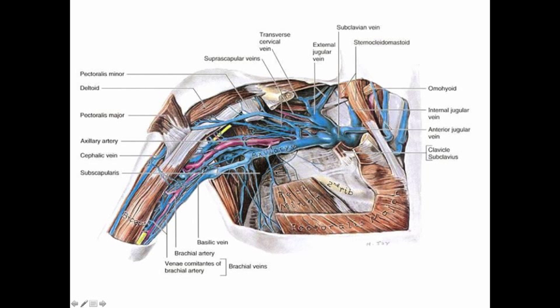The subclavian vein can also be imaged with ultrasound for vascular access. I think this is something we don't do quite as often, but there's growing evidence that we should. While the subclavian vein lies under the clavicle, as it extends out towards the axilla, it becomes the axillary vein, technically just a continuation, and really the place of access when you're using ultrasound to access the subclavian is technically the axillary vein. And I'll show you how to image that as well.